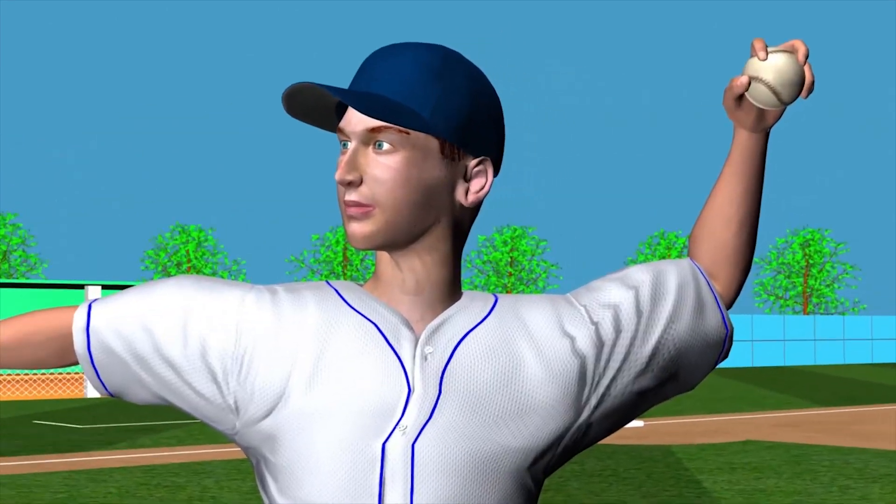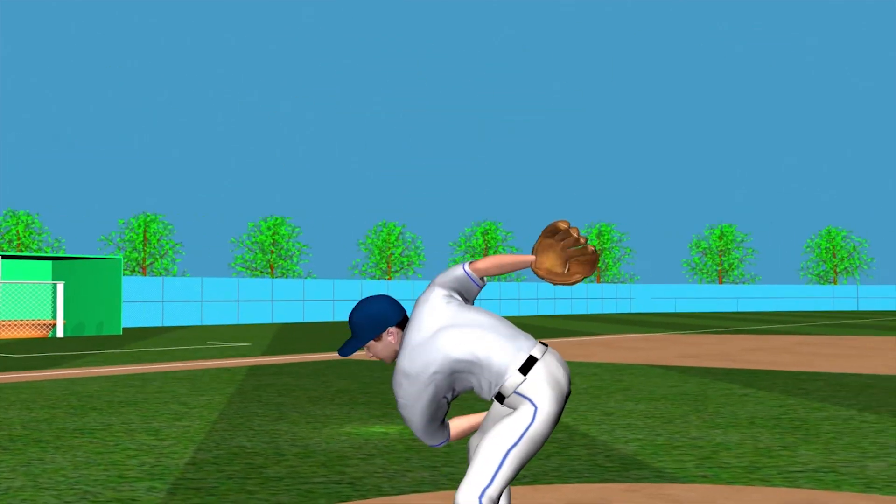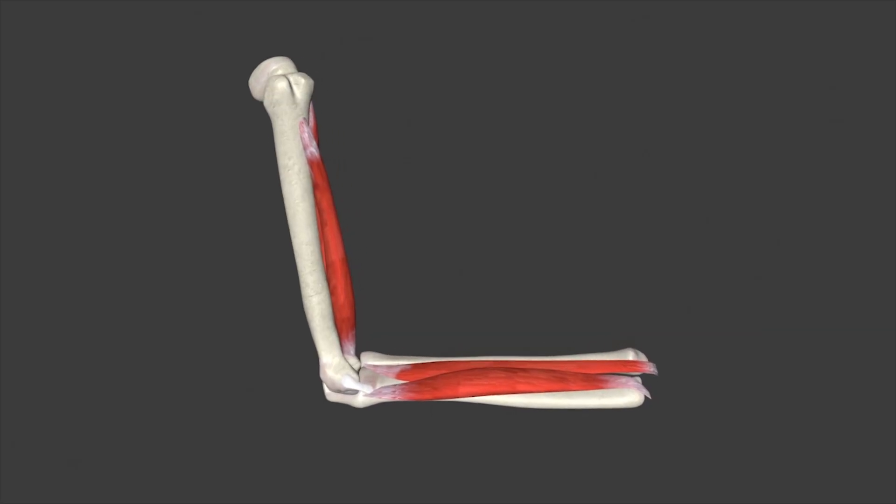In this animation, we'll show the UCL surgery with a gracilis tendon graft in a left-handed baseball pitcher. To get started, let's check out the anatomy.